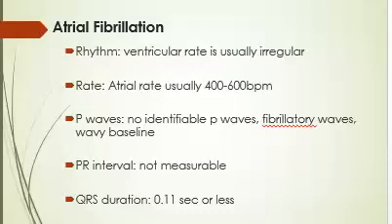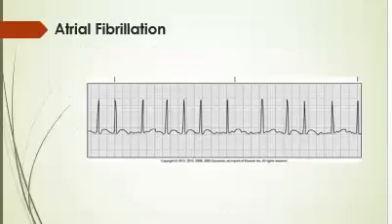It's just shaking. And the bad thing about that is anytime the ventricles or any of those chambers, including the atria, are not completely contracting, the blood is pooling in there. So anytime blood pools, yep, you got it, clots. So this is how it looks. I'm not sure if I said it on the last slide, but it's not a regular rhythm.